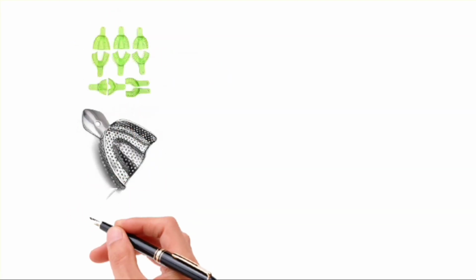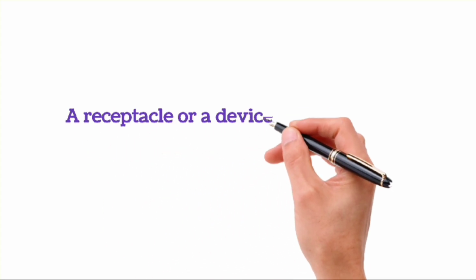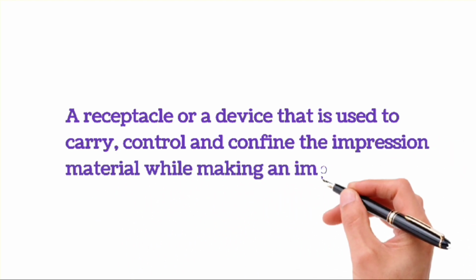Today we will discuss the impression trays. Let's start with the definition. A receptacle or a device that is used to carry, control and confine the impression material while making an impression.